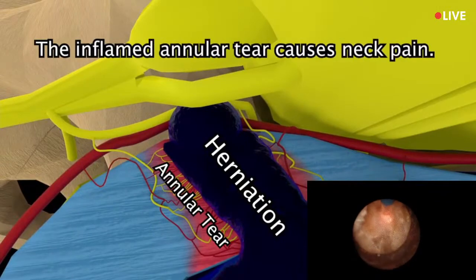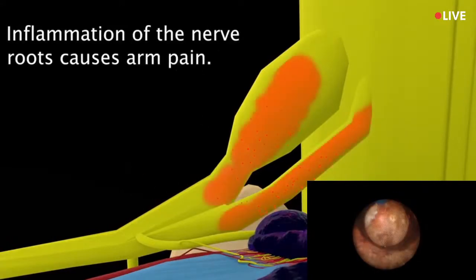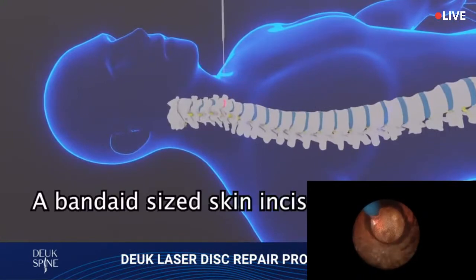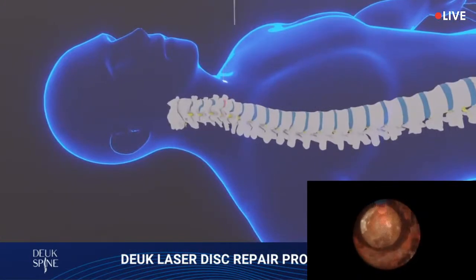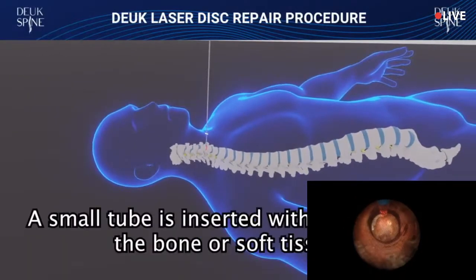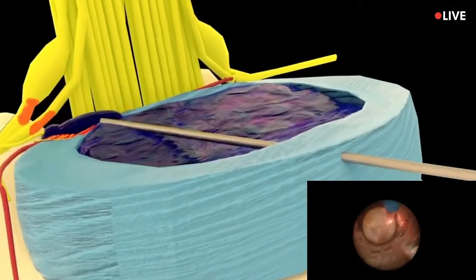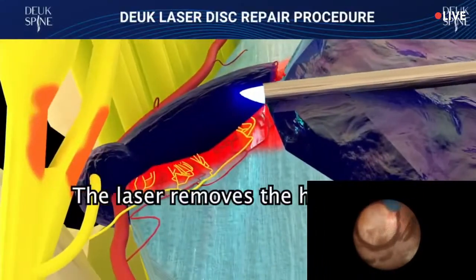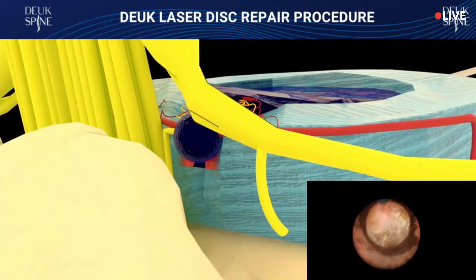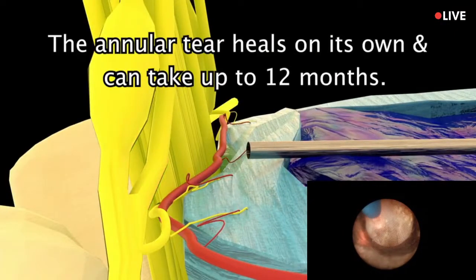Annular tear causes neck pain. Inflammation of the nerve roots causes arm pain. A Band-Aid-sized skin incision is made. A small tube is inserted without damaging the bone or soft tissues. The laser removes the herniation and debrides the annular tear. The annular tear heals on its own. It can take up to 12 months.